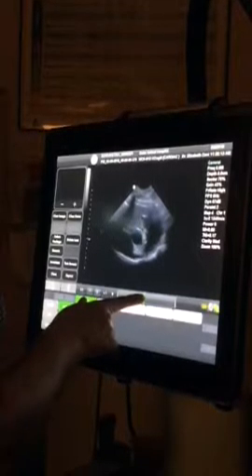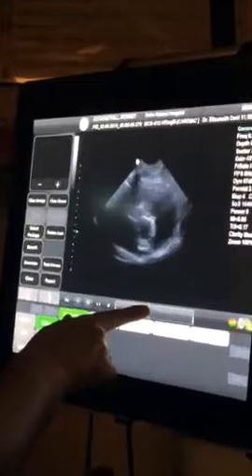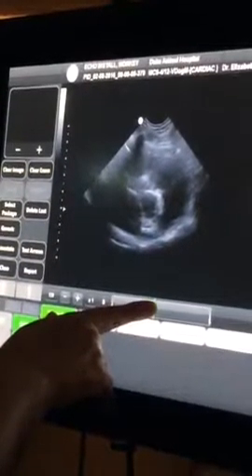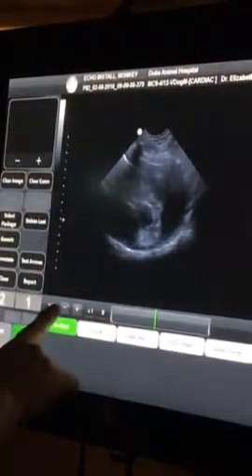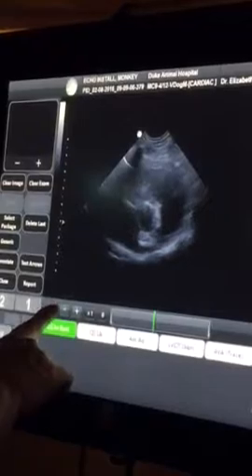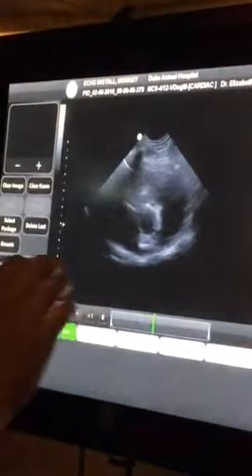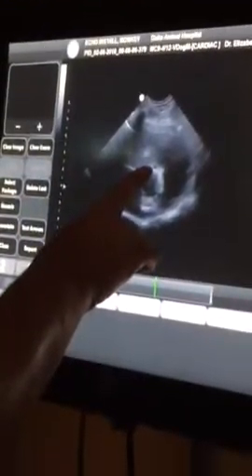Did you say we want it in diastole? Yeah, because actually there are two sets of parameters — one in diastole and one in systole. So what we shoot for, we just kind of move it to the widest section. That way we know we're pretty much as far as it'll go out. And you can see how your line's a little more thin in the middle — so you can kind of see the aortic root first.